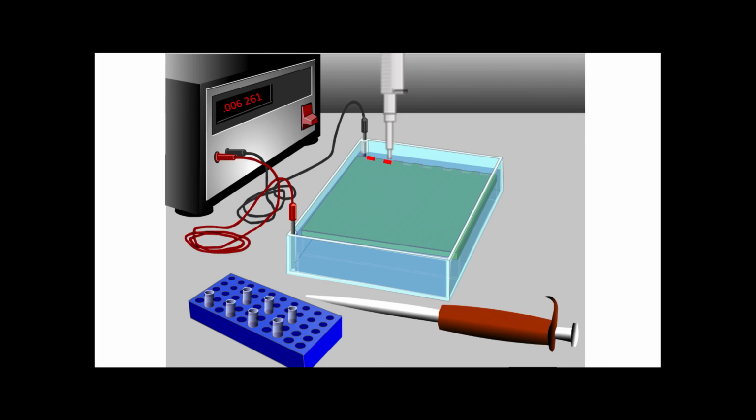After that, you turn on the electrical power, and the voltage generated by this electrical power will make the ions in the buffer solution in your electrophoresis move, and that movement will cause now the migration of the molecules or the proteins present in your specimen. So they will be separated as bands. So you can now remove this support medium and stain it, and then you can visualize now the electrophoretogram patterns.